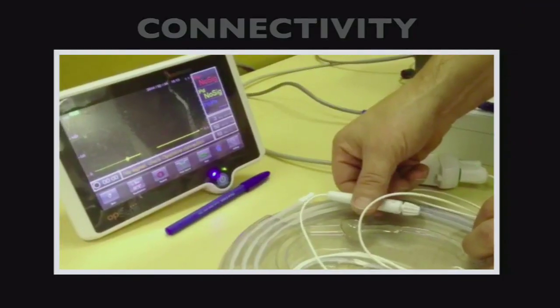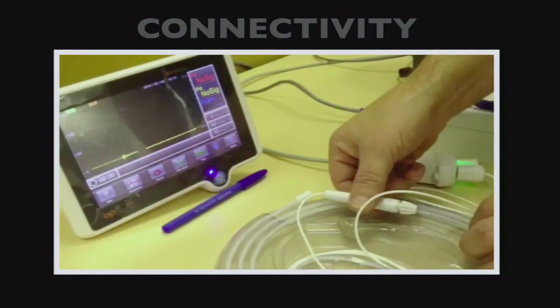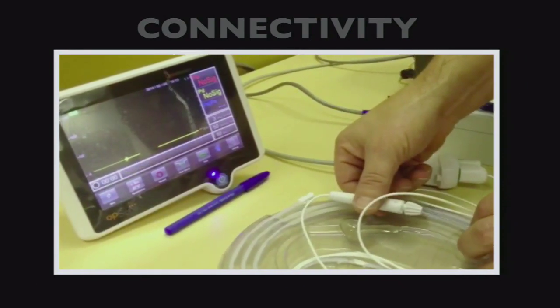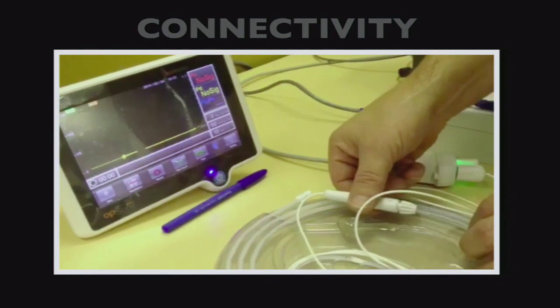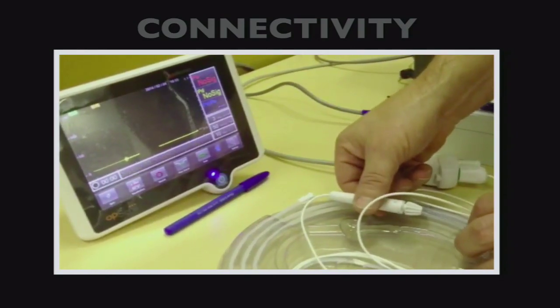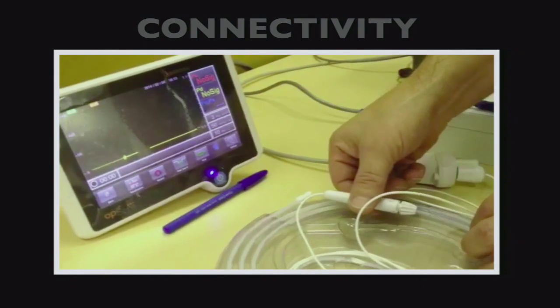So I'm just going to show you the connectivity that we couldn't see, but you see there are two ways. First of all, you see the green line, but because it's fiber optic, it's a transmission of the light. So with this fiber optic connection, in fact, you also get the sound. So you get an immediate signal that you are reconnected, and you don't get the pressure drift because of the fiber optic transmission.